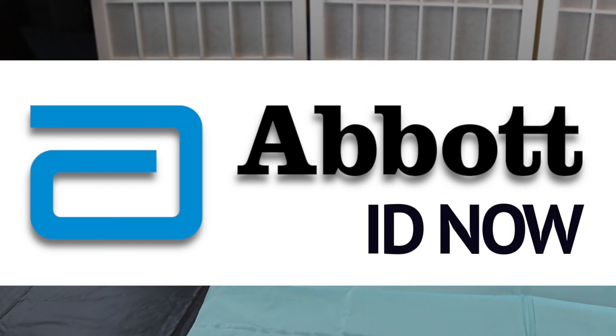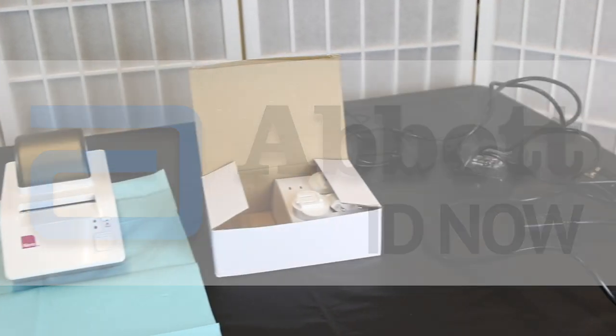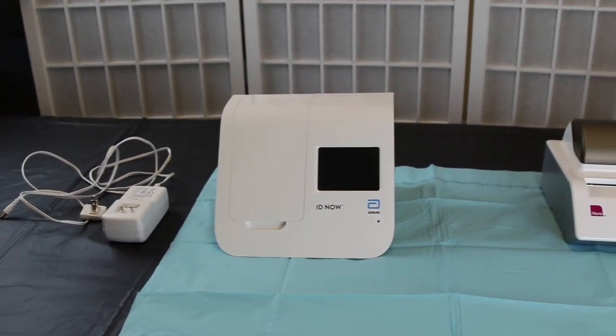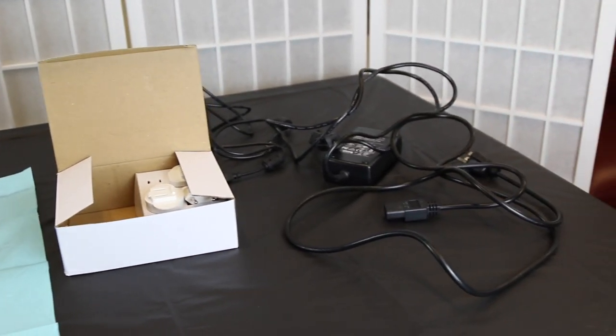The Abbott IDNOW Rapid Testing Unit is the gold standard in rapid testing technology. When you receive your Abbott IDNOW unit and printer, ensure that every component has been included. This includes the IDNOW, printer, and their power cables. Do not throw away any Abbott boxes — they will be needed.